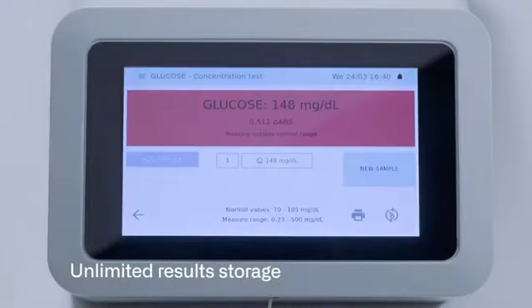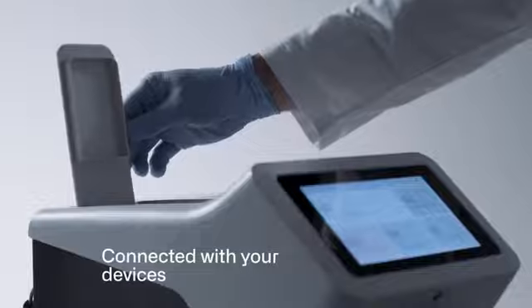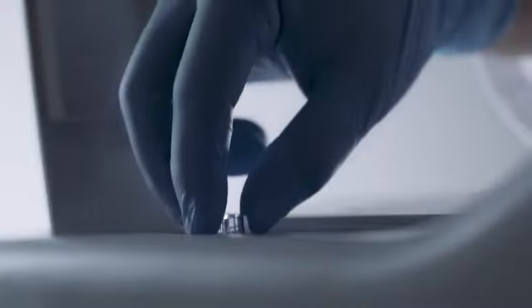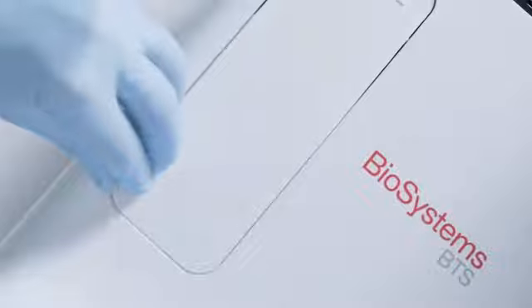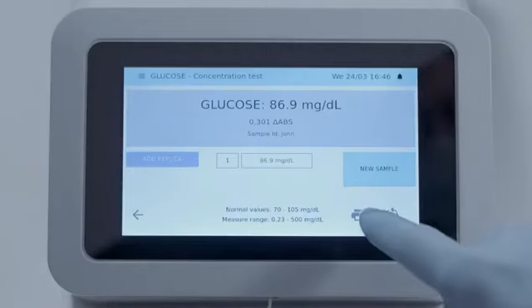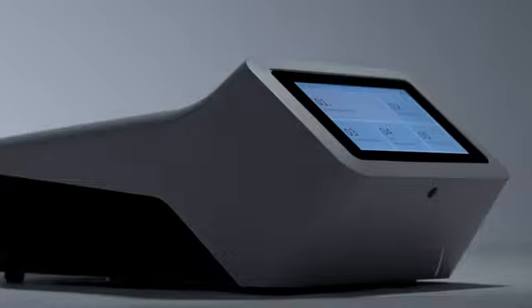This is due to it being able to handle a lower number of samples at a time as compared to the fully automatic one. For this, the samples and reagents are not pre-prepared and stored, but set up separately each time a test is conducted. That is why it is semi-automatic. Though this slows the process of testing as a whole, it has a great benefit as it provides tremendous flexibility when the type of tests differ, making the reagents vary each time.